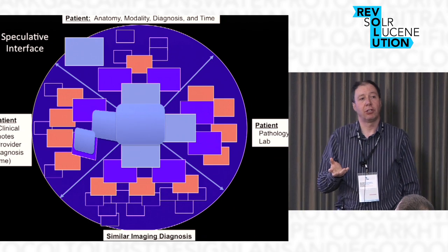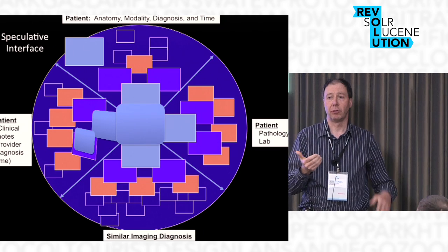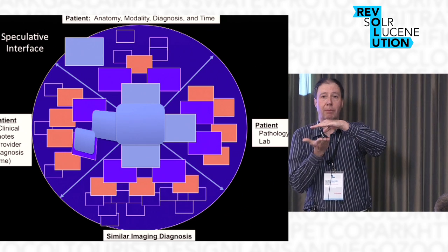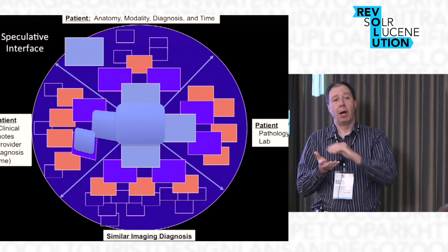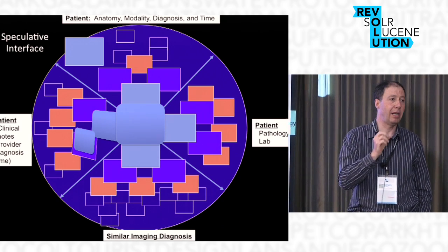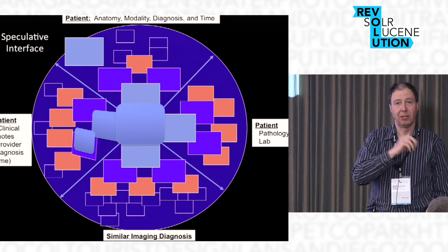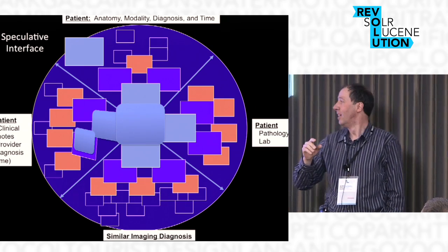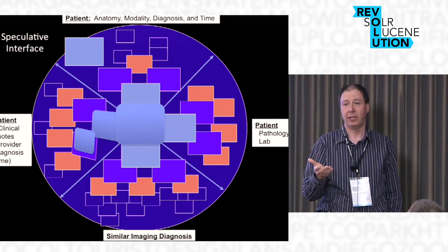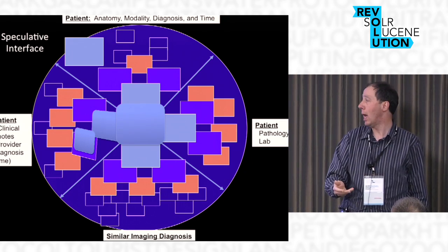So the way we're going to try and address this problem is twofold. We've got the search, we've got good results, but sometimes we get bad results. So we want to bring the bottom up. But we also think that we can't get the radiologist completely out of the loop. There's no way I'm going to be able to tell whether I fixed the bug, right? So the other component of this is coming up with a user interface that will display the search results in a meaningful way.